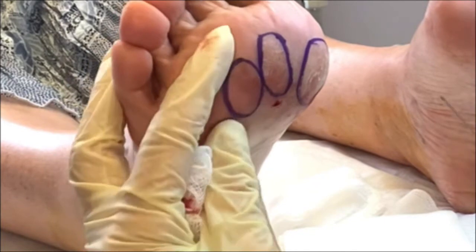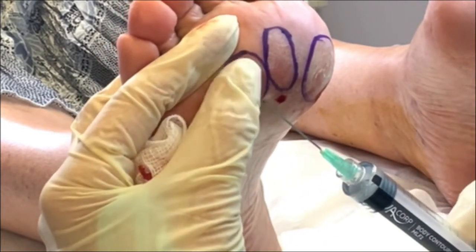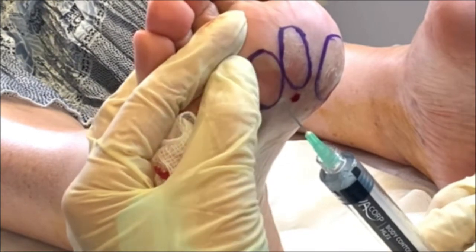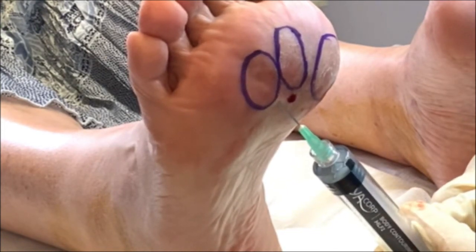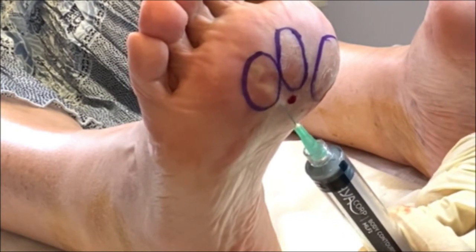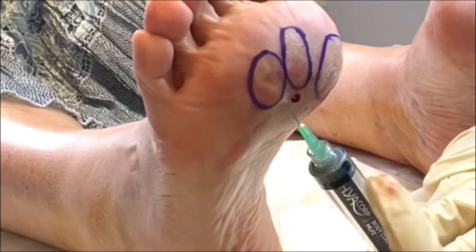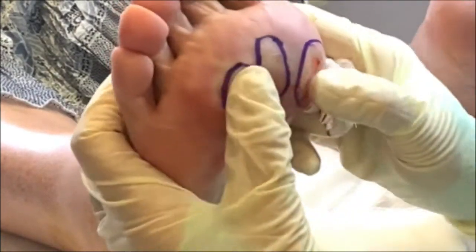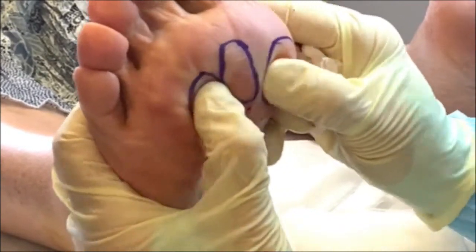So the final area, which is here — now I can really feel a bony point here, so I'm going to feed the needle up to that point. There's the point just there. I'm just going to get that last bit. Underneath that surface there, you can see the filling there, can't you? Just blanching underneath the skin. I'm just now going to massage this layer into place.